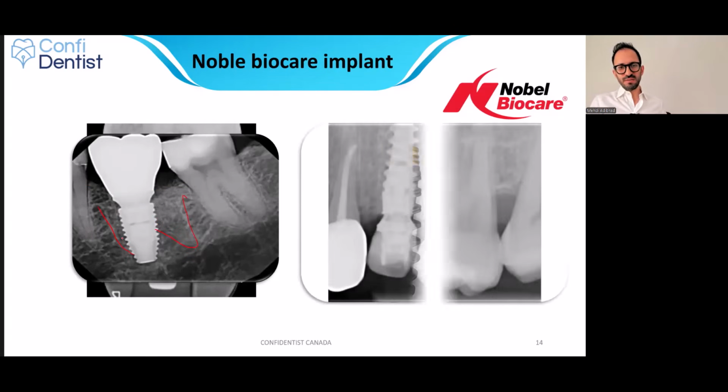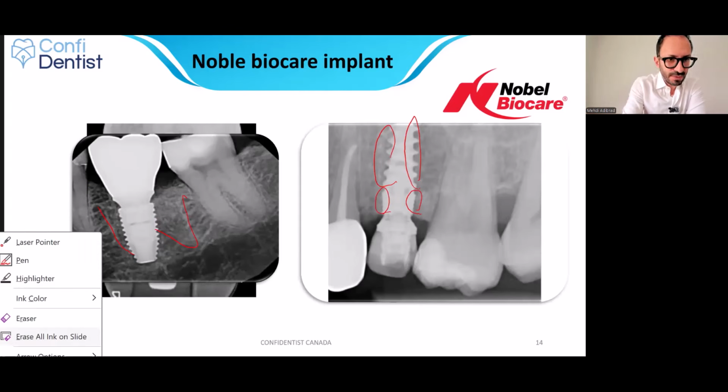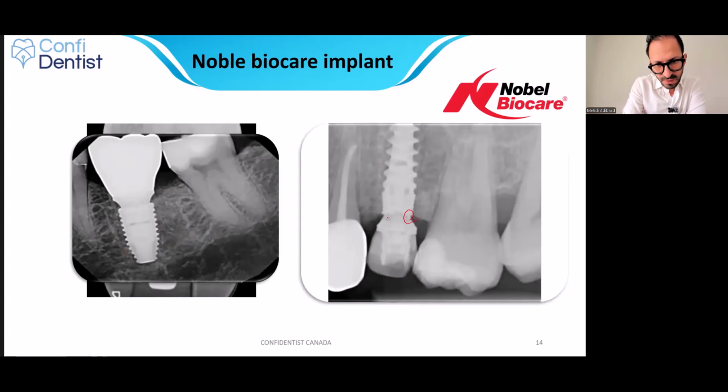Okay, and let's see one example of Nobel Active, way more aggressive threads. The coronal 2 to 3 millimeter, we see the micro threads. And this fine platform switching that makes this case very obvious, okay?